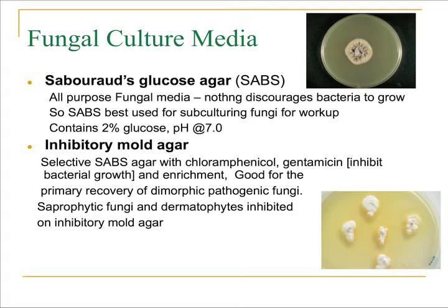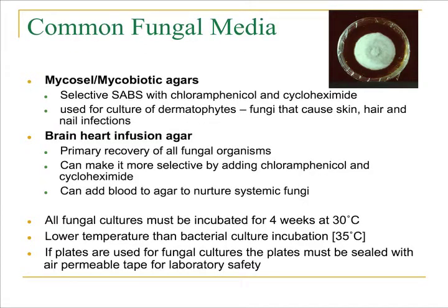On the next slide, we talk about more common fungal media, including mycocell and mycobiotic agars. This is a selective SABs formulation that contains chloramphenicol and cyclohexamide. These agars are primarily used for the culture of dermatophytes, which of course are infections that occur in skin, hair, and nails. Brain-heart infusion is also commonly used in mycology laboratories. It can recover all fungal organisms. It is made selective by adding chloramphenicol and cyclohexamide, and you can also add blood to this agar to nurture the systemic fungi.